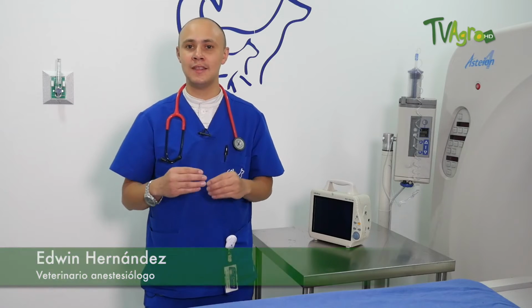As you know, our body and all organisms are composed of almost 70 to 80% water, and hydrogen atoms are there. What a resonator does, or what a magnet like that does, is align them, and by aligning them in some way or another, obtain images. It's a totally different study.